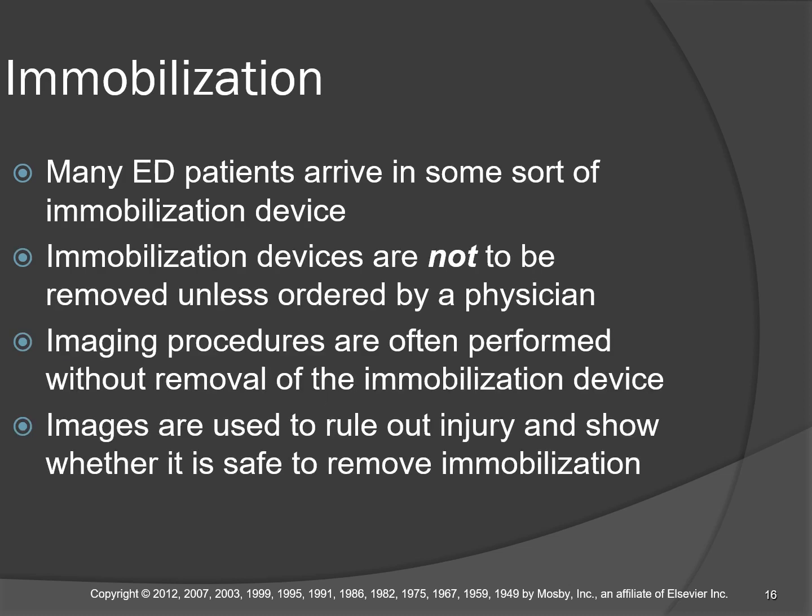Okay. Immobilizers, sometimes they arrive with immobilizers. As far as scope of practice, techs are not allowed to remove them. Now, I can remember clearly, I would go with a portable machine to a certain ER suite, right? Let's say it was bed 25. I'd roll over there. They got an immobilizer.